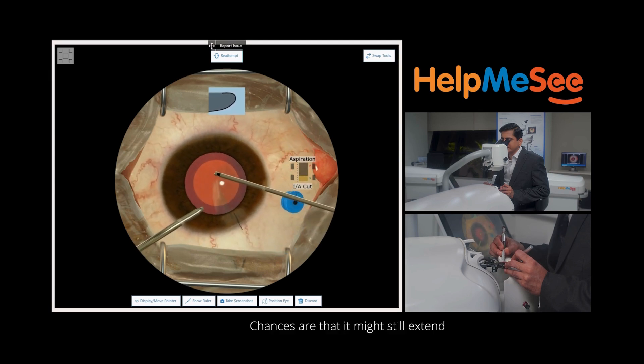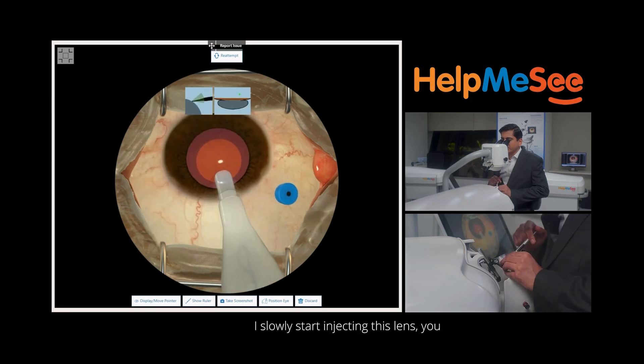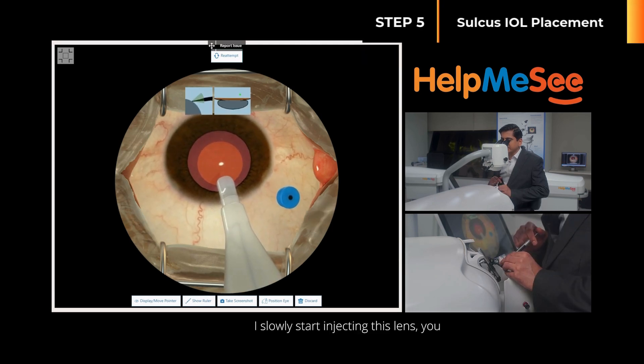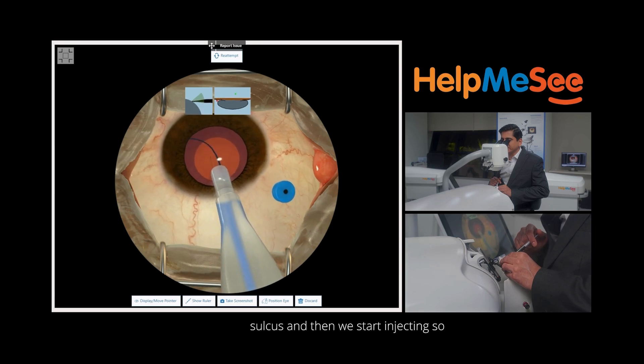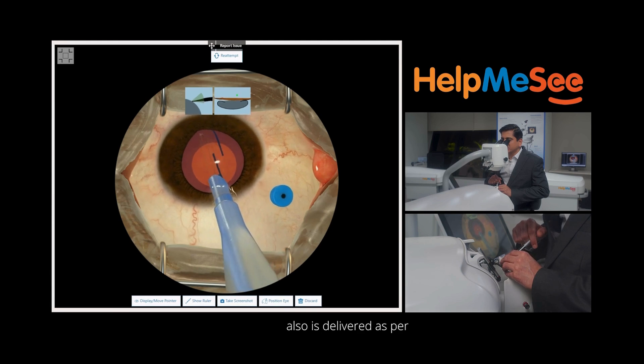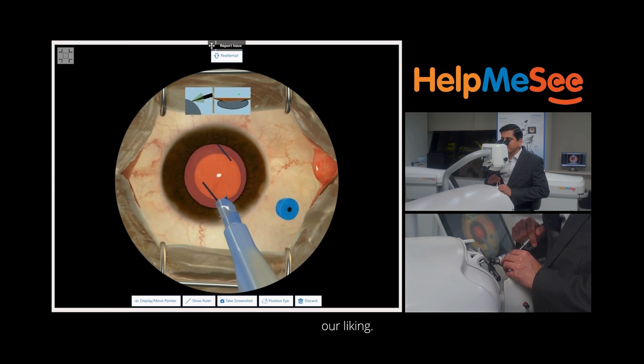I slowly start injecting this lens. You can see the lens now coming out of the injector. First is the leading haptic. We have to ensure that the leading haptic is placed within the sulcus and then we start injecting so that the trailing haptic also is delivered as per our liking.